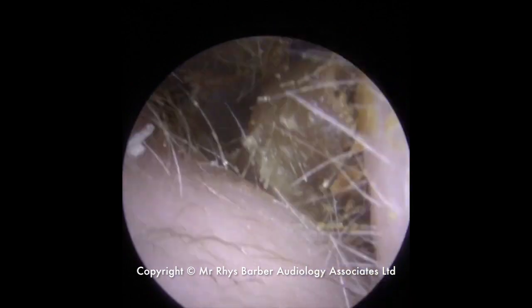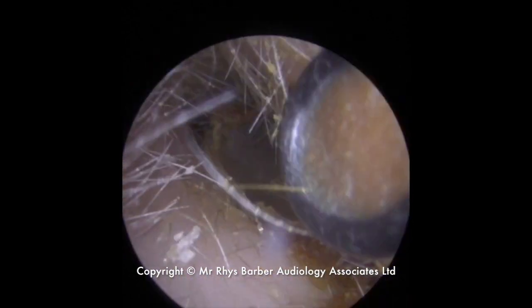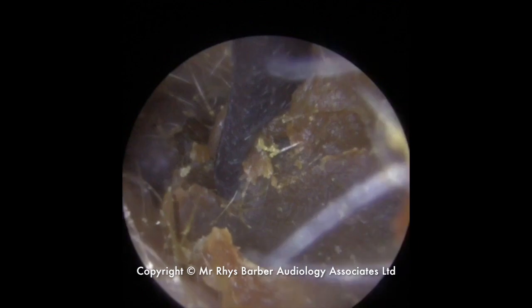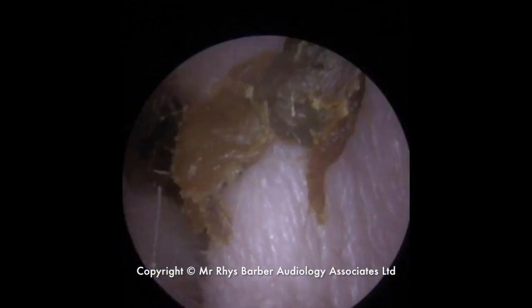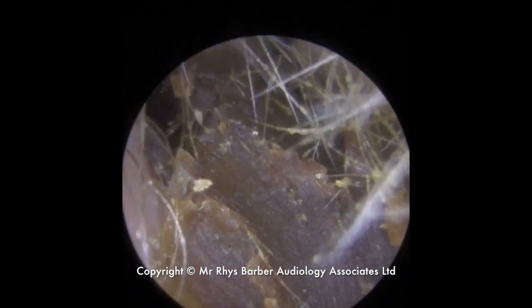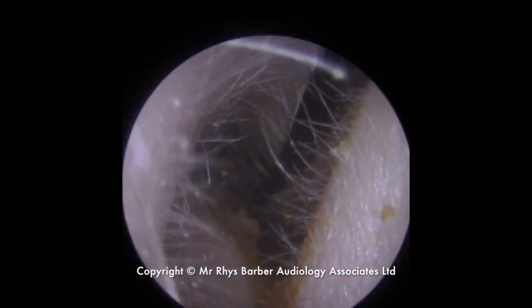So what we've opted to use is a Jobson Horne, which you can see us using here. So we're just going into the wax. You can see it's got this very smooth consistency as you take it away. So it's coming away quite nicely so far. Still can't see the eardrum just yet, so we're still chipping away at this wax, just trying to get over the top of it if we can, to get that slight bend on the Jobson Horne behind it so we can remove it.